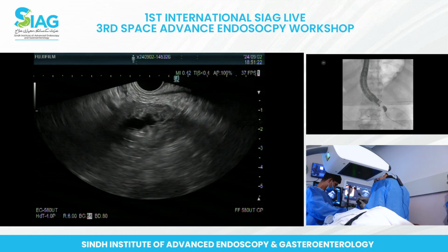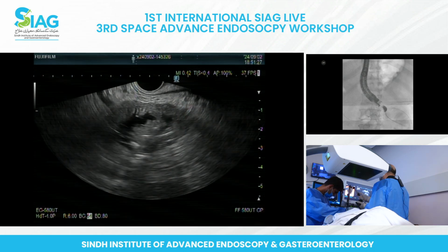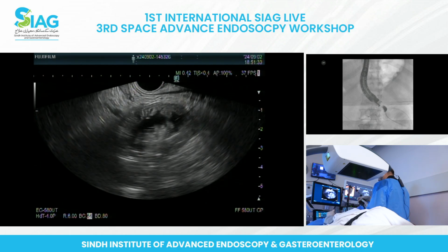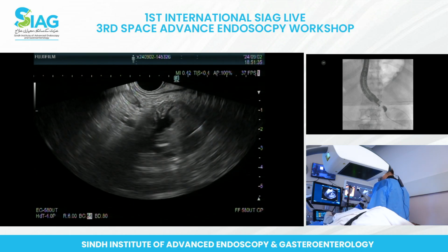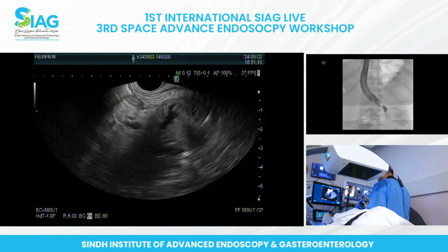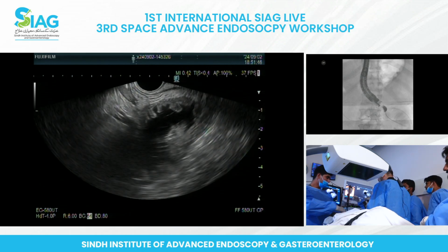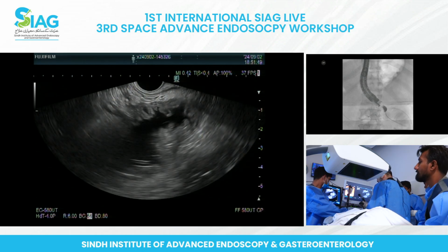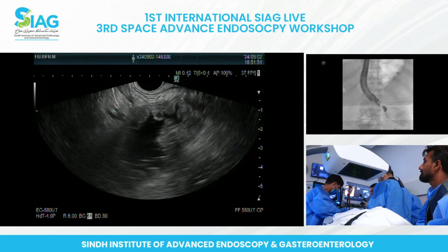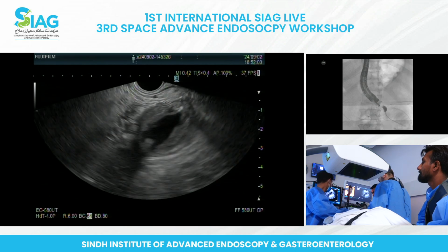So once I'm in position and I deploy, I won't go through the steps because it's a time-sensitive deployment. But just before we do that, I'm going to go through the steps. So here's the tip of the stent coming out. And we need to distend this more. So once we have a very nicely distended loop of bowel and we find our window, we can go for it.